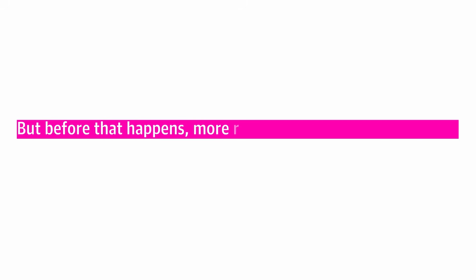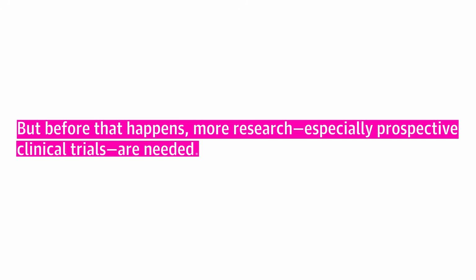But before that happens, more research, especially prospective clinical trials, are needed. The way we do approach these things is really the way that medicine usually works, which is to say, let's do validations of the method again and again and again until we're reasonably confident that it really works on many kinds of images in many settings for many different patient populations. And so from my perspective, that's really, end of the day, what's most important. Does it work on real patients, and is it reliable? The excitement generated by early results has already spurred several research groups to look into the efficacy of CNNs in clinical practice, which could potentially finally get CNNs from the bench to the bedside.